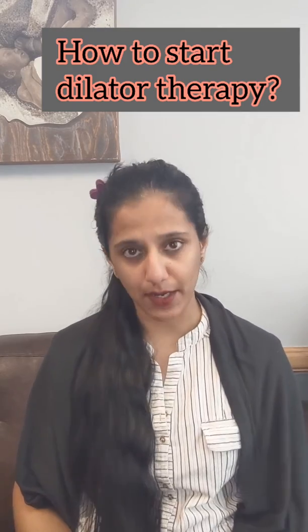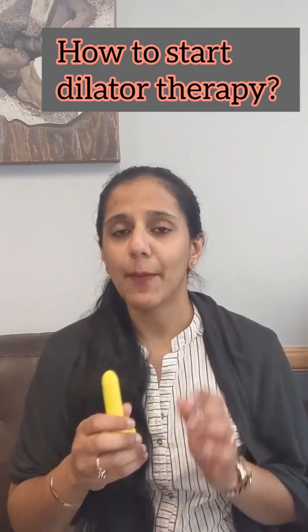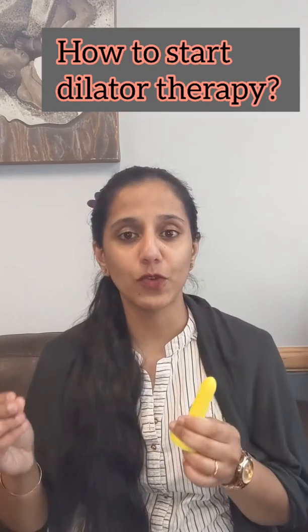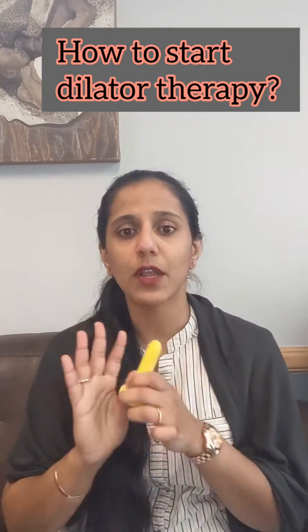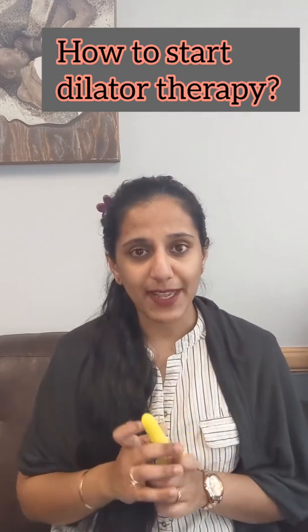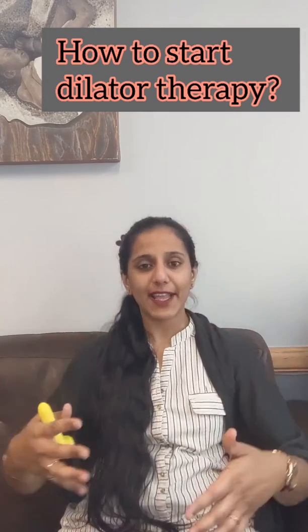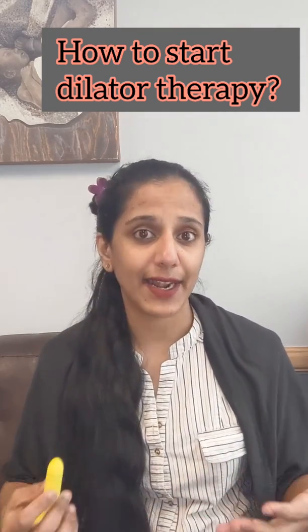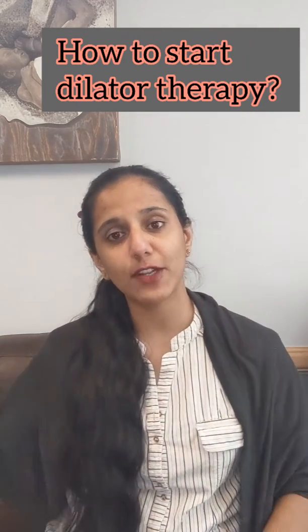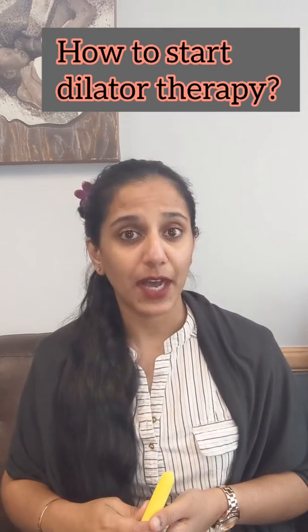So let's get started. Let's imagine you're going to start off with dilator number 2. That's where you are. You're going to find a nice comfortable space. You're going to use the lube recommended, like a water-based one or whatever your product manufacturer recommends. You are going to lube it up nicely. You're going to be in a comfortable position. So laying in bed or reclined like this with your legs up in a V, that is helpful, or one knee up bent and one leg out straight so you can access your vagina easily is also another option.